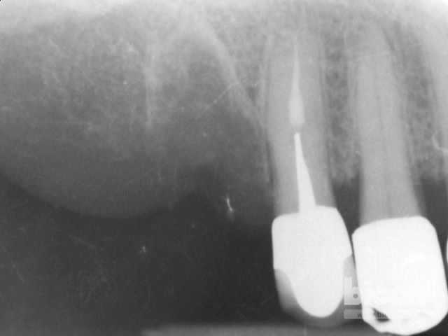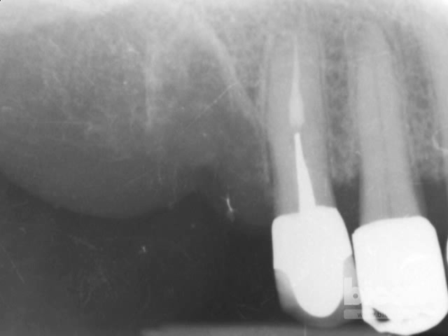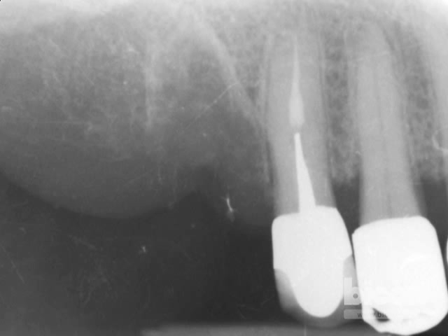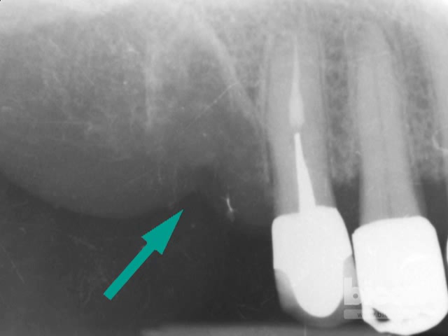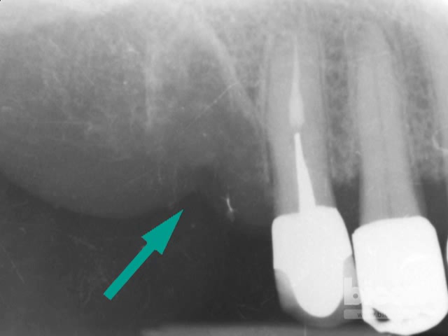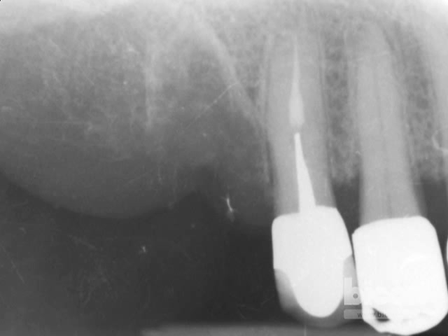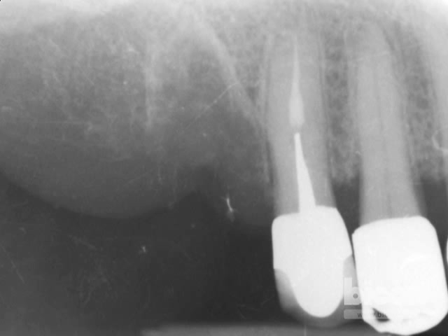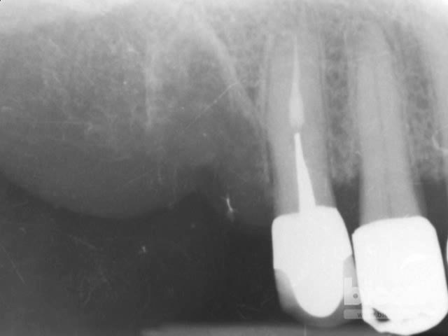You can see the two bicuspids are present. The molar — you can see the shadow of the socket still remaining, and if you look closely the shadow of the soft tissue is a little irregular. This will translate clinically. We will be placing a Bicon short implant with a one-stage technique — in other words, a healing abutment will be visible through the gingiva, allowing healing and making the second procedure of taking the impression much faster and easier on the patient.